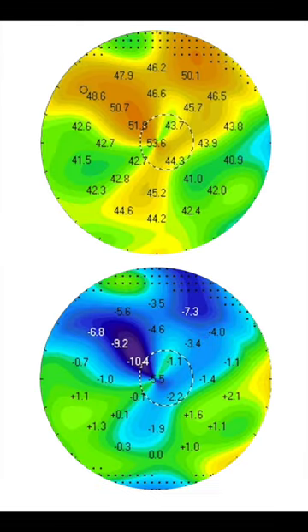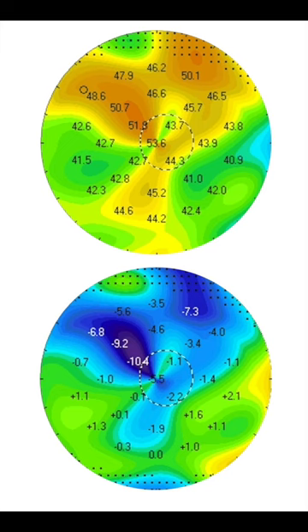There's two images here. The top image is the topography prior to the PTK and the image below is the difference map between the pre-PTK topography and the post-PTK topography.